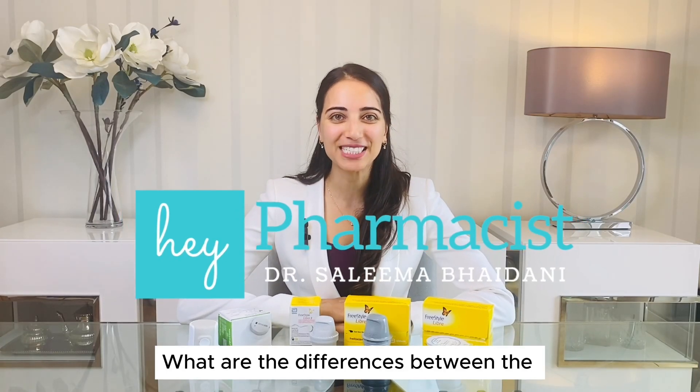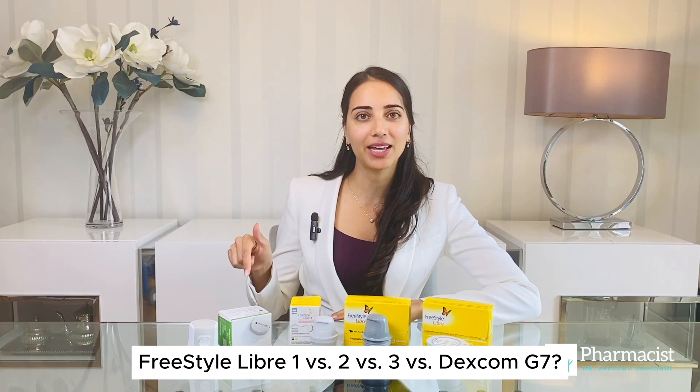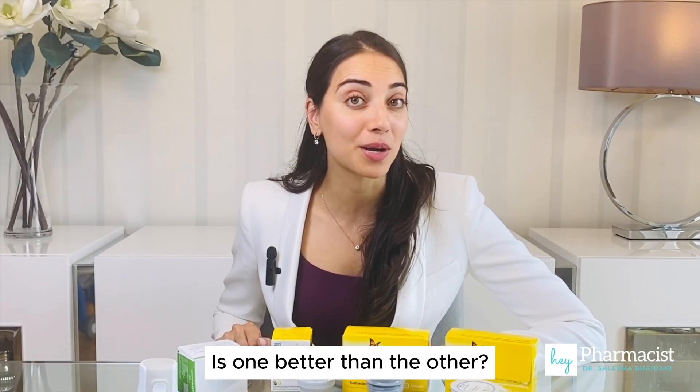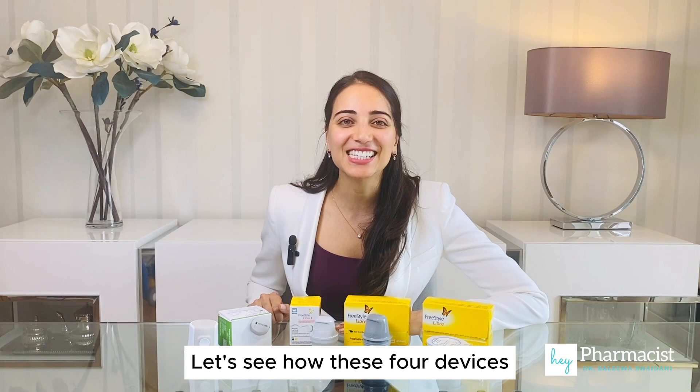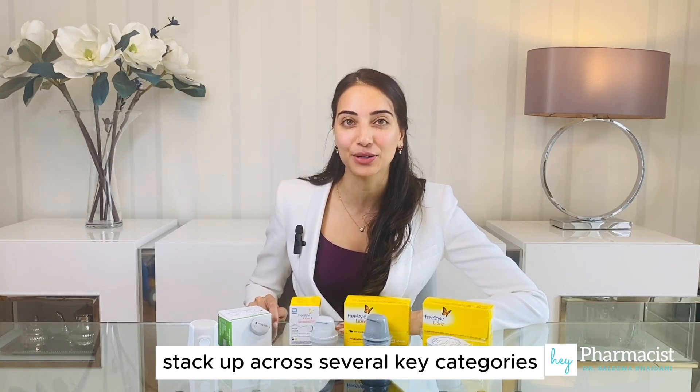Hey pharmacist, what are the main differences between the Freestyle Libre 1, 2, 3, and the Dexcom G7? Which one is the most accurate? Is one better than the other? Let's see how these four devices stack up across several key categories.